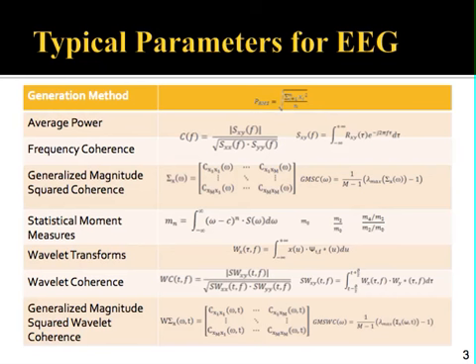So typically, let me just say, before we go into each individual parameter, let's take average power as an example. So the parameter average power, and I'm sorry, my table's a little bit off, so here's the actual equation for average power, off by a line or so, but typically average power is calculated within the frequency bands that were shown on the previous page, usually at least the first four.